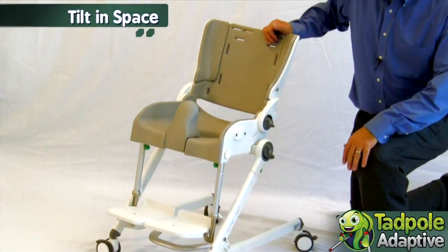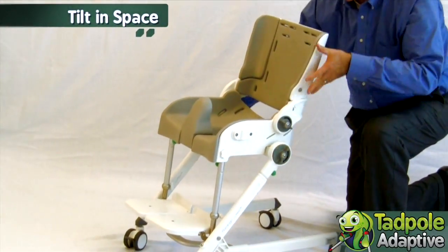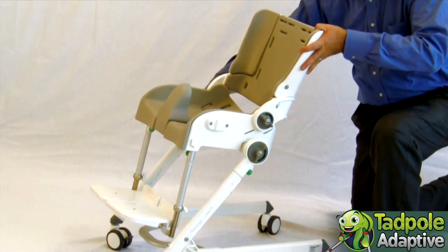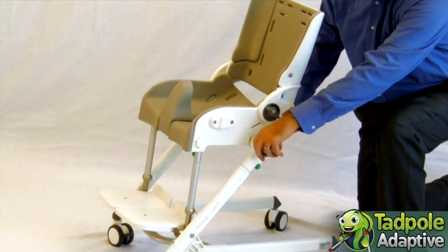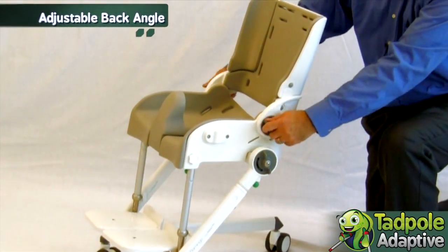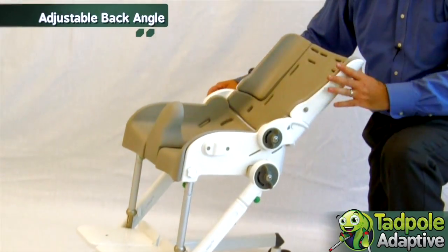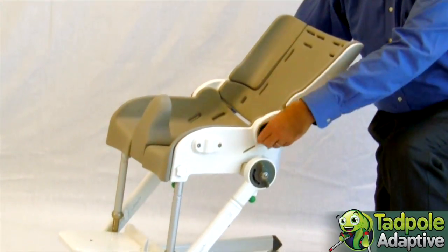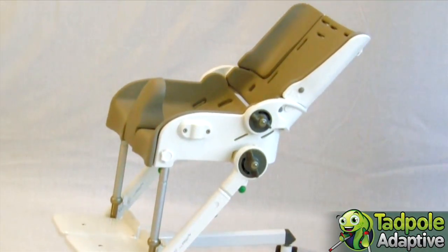The Flamingo has tilt-in-space that locks in with the gray knob, as well as an adjustable back angle which is good for positioning and hair washing.